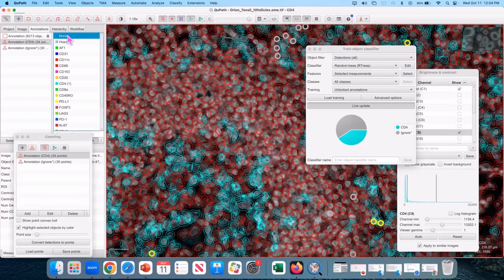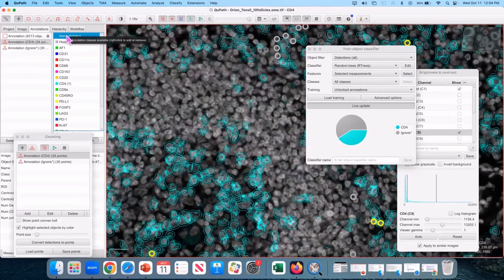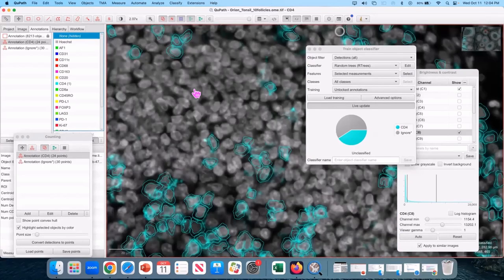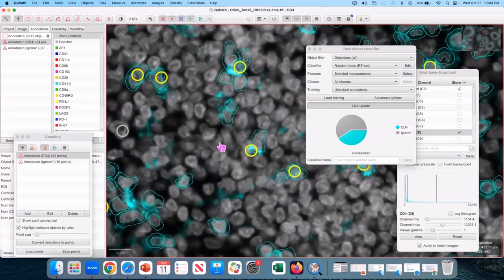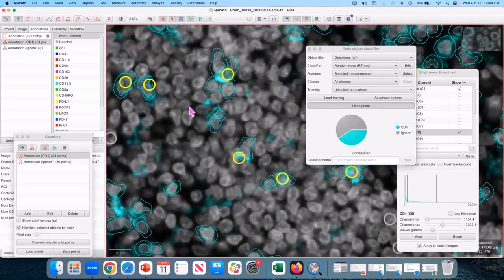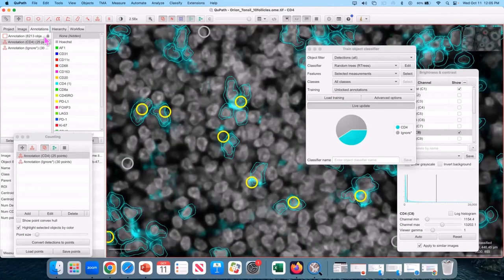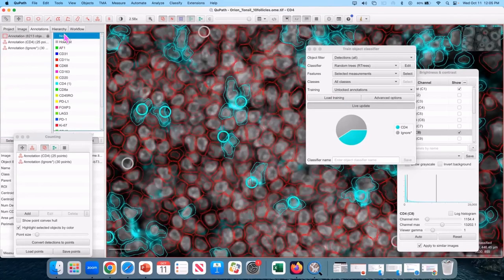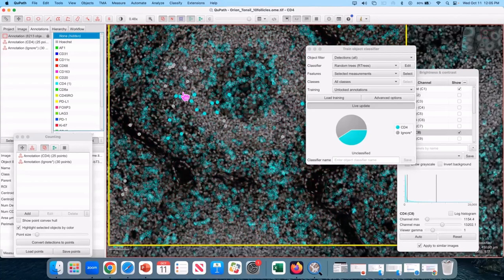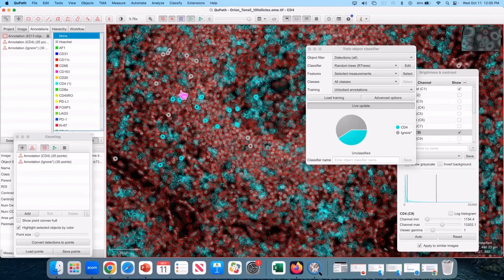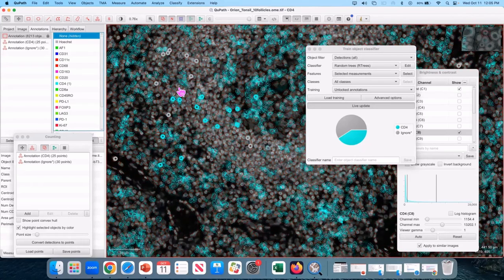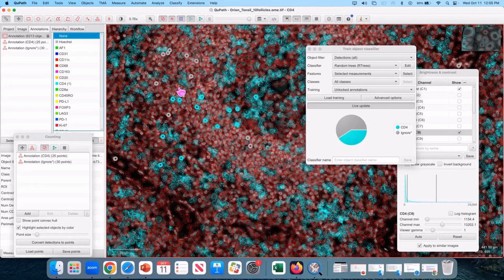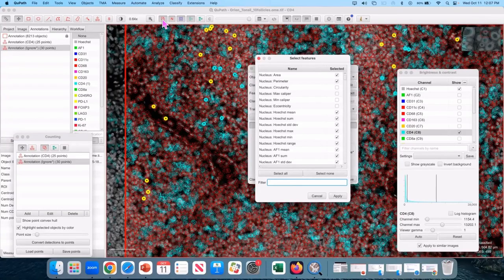The trick I like to use to make training the classifier a little easier, select none and hit space and it clears all of the red. And it just makes it a little easier to find what you're missing, at least find the positives you're missing. If you still kind of can't see the false positives. We did just add this to one person where they're drawing annotations around the cells, very high detail level, but they're not crossing any of the centroids of the cells. And you need to make sure you're crossing the centroids of the cell when you're drawing an annotation.